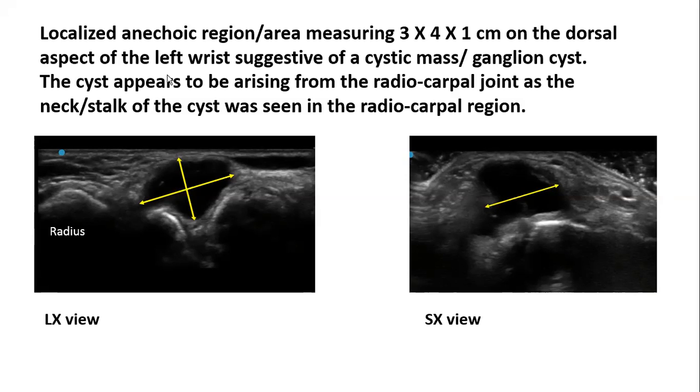I had a case where there was a mass on the 5th digit, and that was a schwannoma. It was confused with a cyst based on MRI. So before I did the ultrasound, somebody did the MRI of that region, and they thought that's a cyst. And then the surgeon attempted aspiration based on that. So yeah, that was solid. So you know what you have to do? You have to scan it, go proximal and distal, and see. So that mass was continuous with the ulnar digital nerve. And that's how you say whether it's a cyst or not. So not just the echotexture.